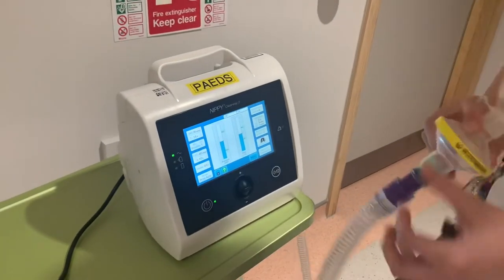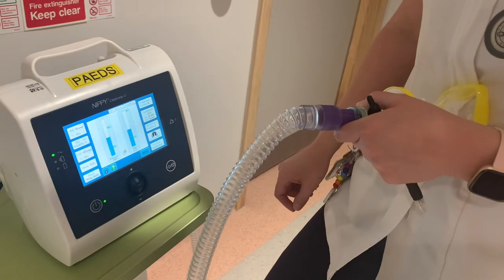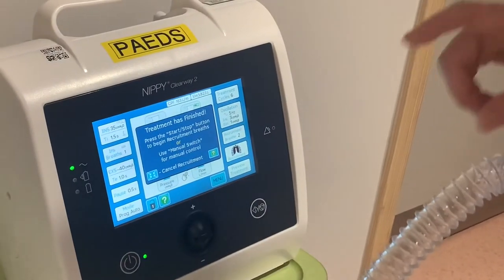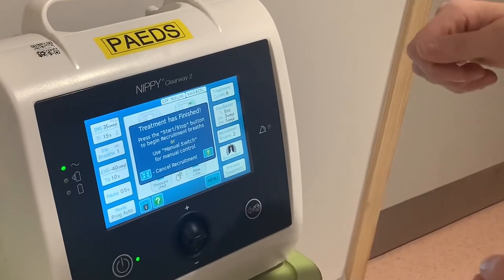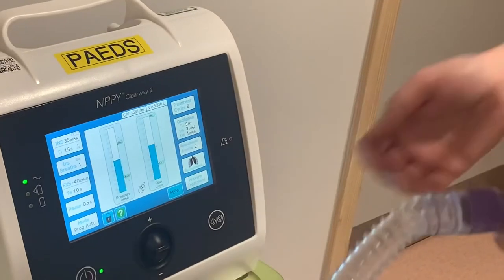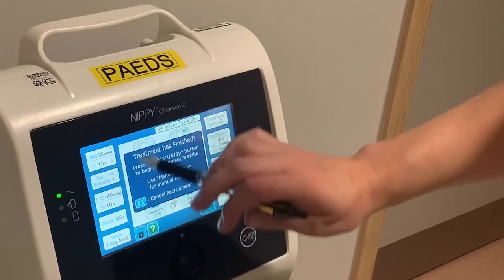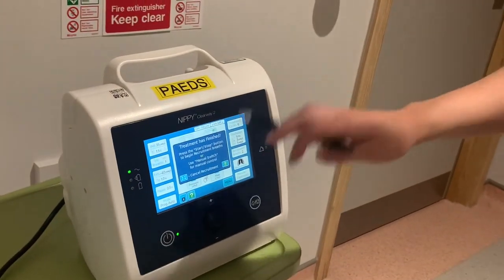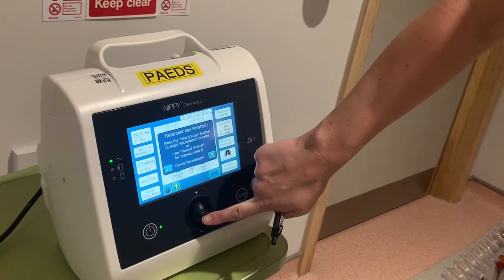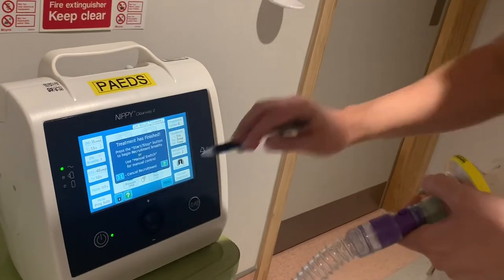Let me plug it in and show you how recruitment breaths work. After starting and completing the cycle, a message comes up: 'Treatment has finished — press start to begin your recruitment breaths.' This delay is intentional — the rep explained you can take off the mask, suction the patient, replace the mask, and then give the recruitment inspiratory breaths, so you're not pushing secretions back down that you've already cleared. This box disappears around two minutes after the cycle finishes. If you miss that window, you can always give a manual breath for the recruitment.